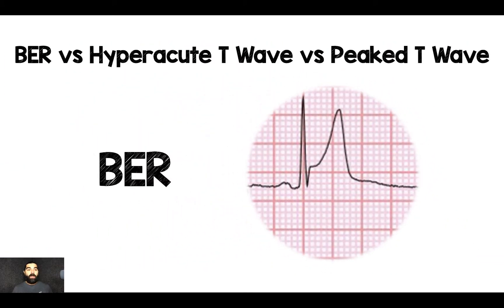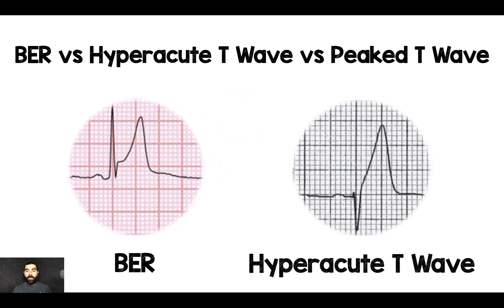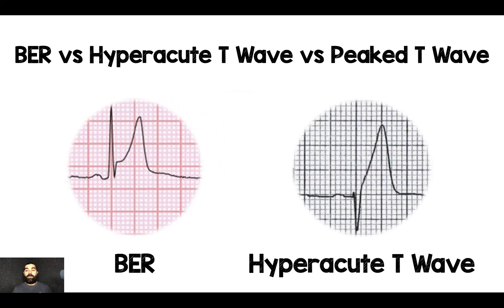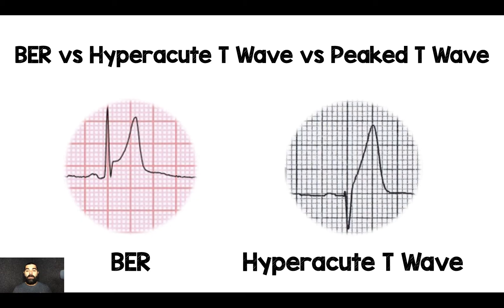Let me zoom in and compare three types of T waves. Benign early repol has a slow upslope and then a precipitous drop at the end — that's more likely to be benign early repolarization. Hyperacute T waves are symmetric on both sides — broad-based like benign early repol, but symmetric going up and coming down, and usually much taller than the QRS. In fact, the QRS usually fits underneath that T wave.